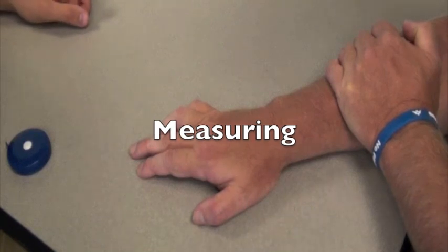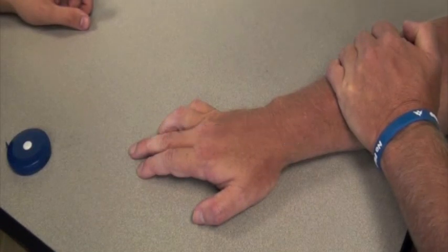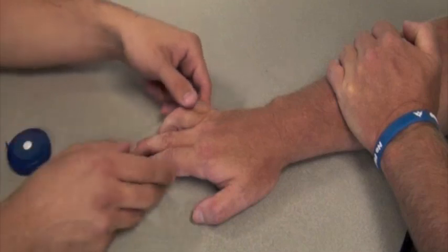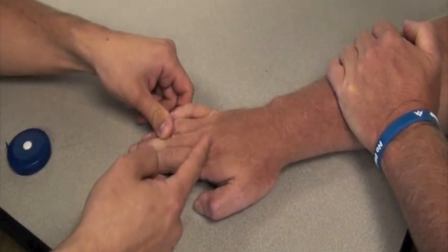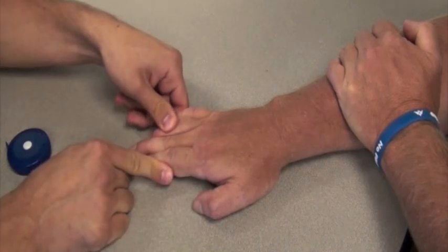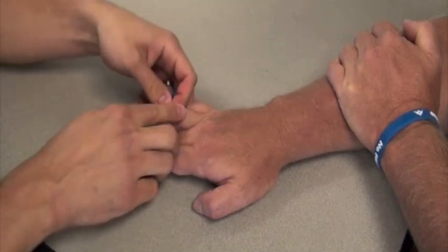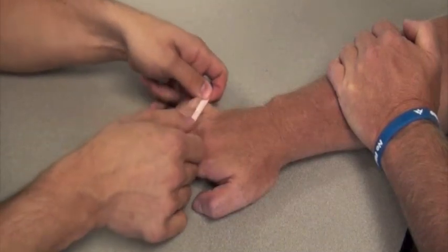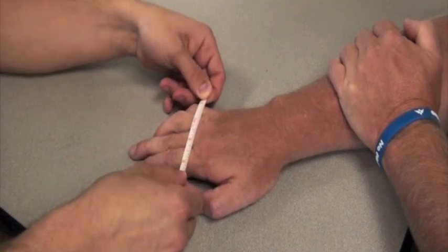Now that we have determined that Tony is appropriate for the Sabo Stretch, it is time to measure him for the device. To assure a good fitting experience, it's imperative that the measurements are accurate and performed correctly. Placing Tony's hand flat on the table, I'm going to take a measurement just distal to the MCPs. You can notice that the fingers are in an adducted position. You want to measure the fingers just distal to the MCPs, but you don't want to wrap around the edges — you want a nice, flat, linear measurement.